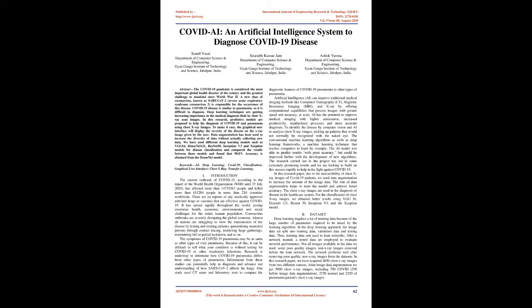Deep learning techniques are gaining increasing importance in the medical diagnosis field through X-ray scan images. In this research, predictive models are proposed to help the diagnosis of COVID-19 and pneumonia using chest X-ray images. To make it easy, the graphical user interface will display the severity of the disease on the X-ray image given by the user. Data augmentation has been used to increase the diversity of data without actually collecting new data.